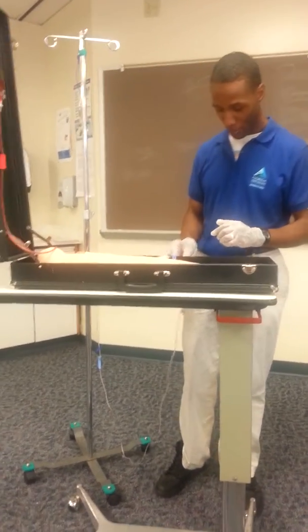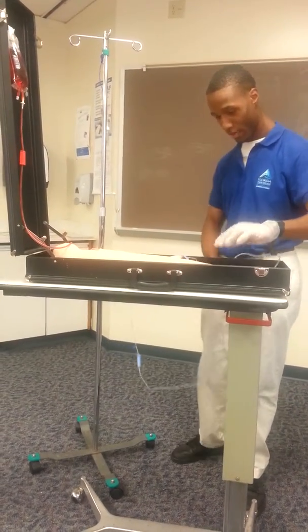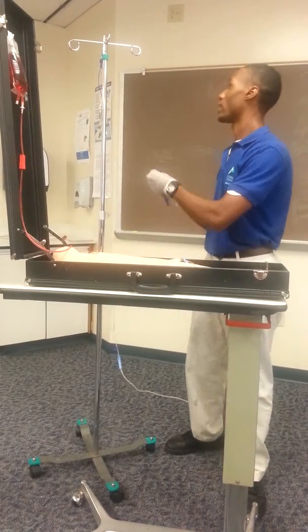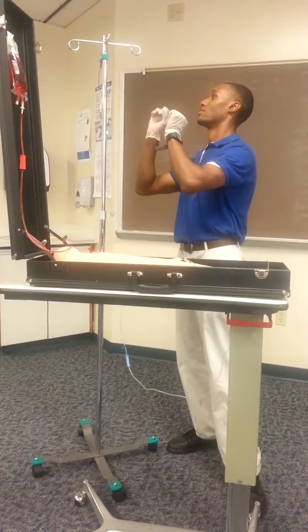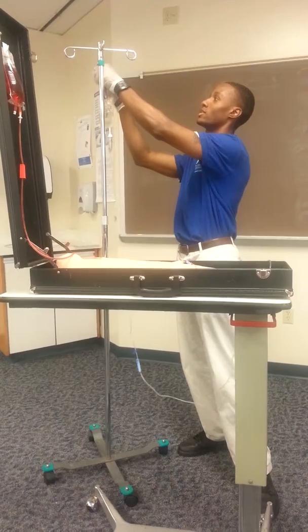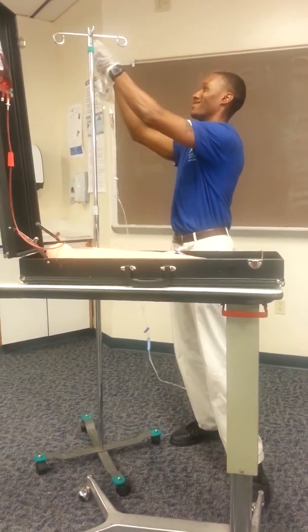I would check the IV line and hang the primary lower than the secondary. And that's it.